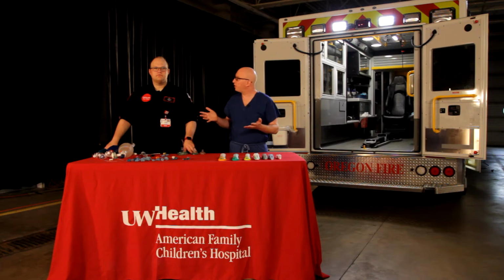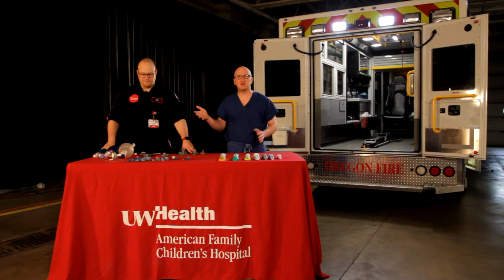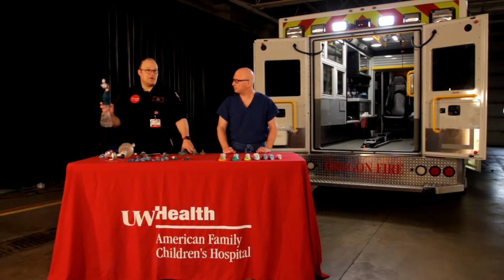And then one really important thing to remember too is that if you have a bag that's too big, that's much less of a problem, particularly if you're paying attention to those pressures. Whereas a bag that's too small is never going to work to give you adequate ventilation of a larger patient. Yes, absolutely. This would not do much for me, so please don't use this one.